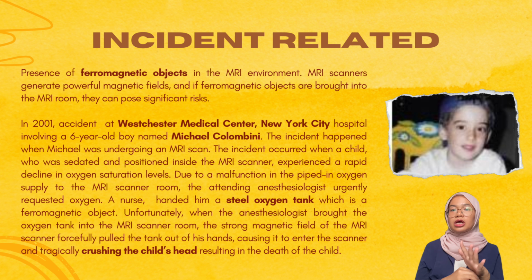The child, who was sedated and positioned inside the MRI scanner, experienced a rapid decline in oxygen saturation level. Due to a malfunction in the pipe of the oxygen supply to the MRI scanner room, the attending anesthesiologist urgently requested oxygen. A nurse, who was not familiar with the MRI procedure, responded to the call and handed him a steel oxygen tank, which is a ferromagnetic object.